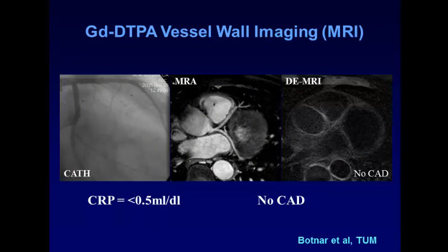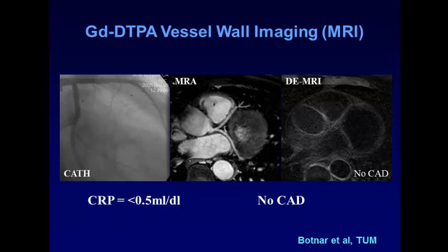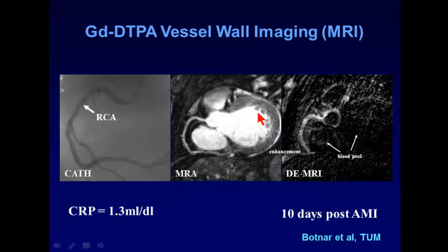And here is one of the first publications on this issue by our colleagues in Munich, by the group of Markus Schweiger, in a patient with visibly a normal coronary angiography. They did MR angiography, and in this case it was really a normal finding, despite using a special sequence. The RCA was still normal.